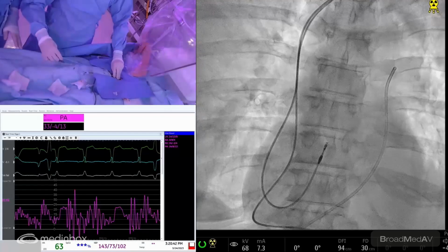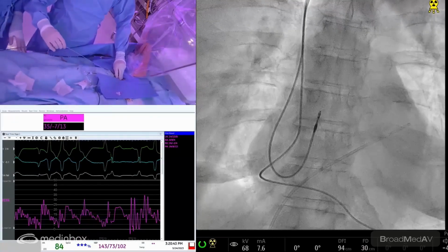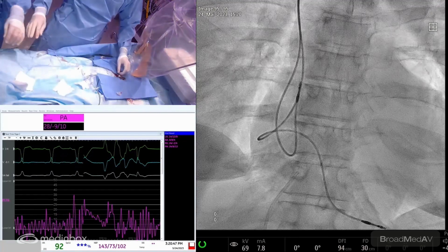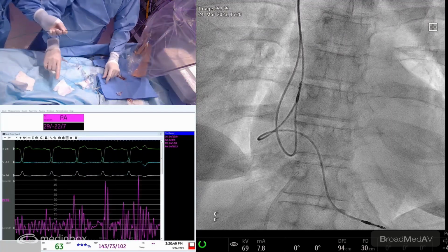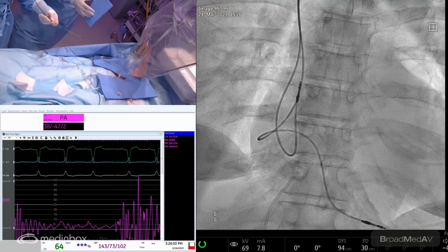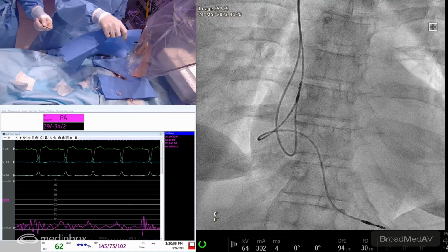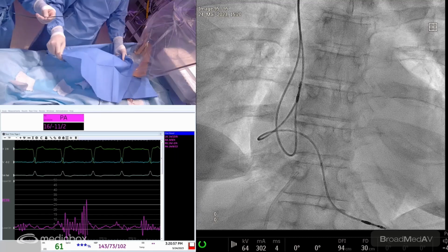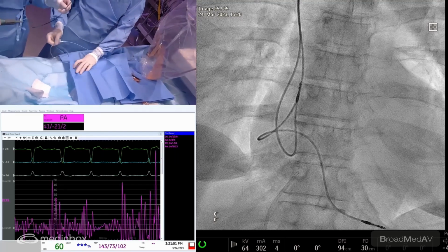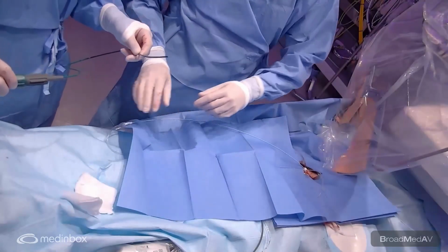Yeah. I'll just go back to the... Let's go back to the IVC with your catheter. Okay, just to park it here for the time being. Yeah. Let's go with the ICE. So this is the ICE catheter that we will introduce. As I said, it's the... I just want to show that. Can you show my hands here and the catheter with the camera, maybe?